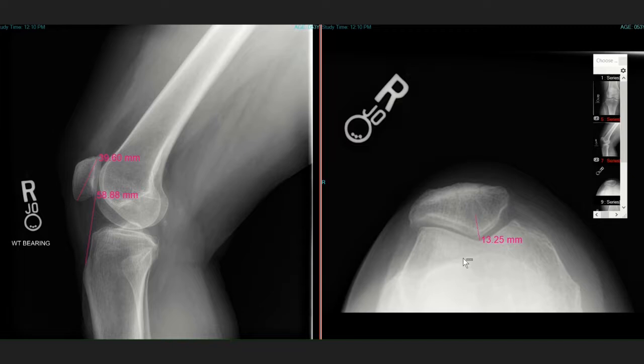So the medical radiologist describes slight lateral positioning of the patella within the trochlear groove, but by this measurement, the patella seems to be fairly well situated within the trochlear groove. So the patellar alignment seems to be within normal limits. If there is any misalignment, it's subtle at most. Next, we want to measure a sulcus angle. So we do that by measuring along the trochlear groove here, both the borders of the trochlear groove to the intercondylar sulcus.